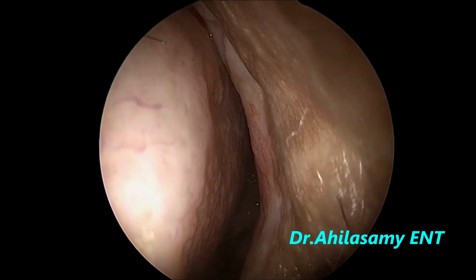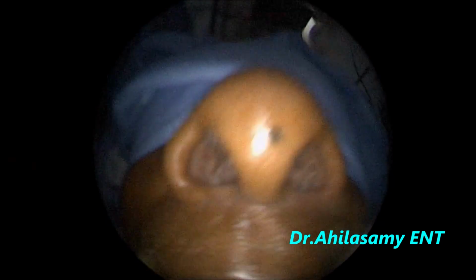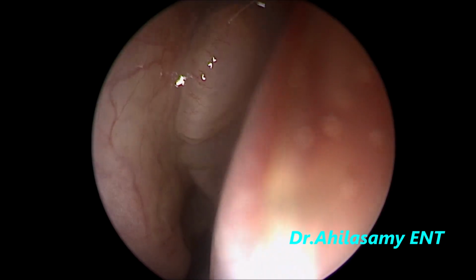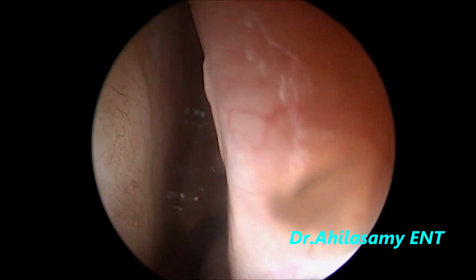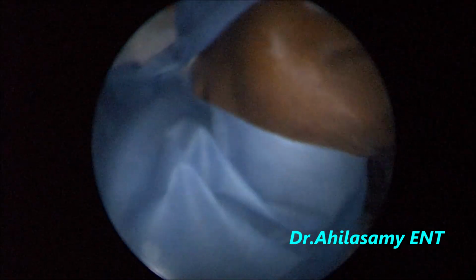This is a diagnostic endoscopy. Septal deviation anteriorly is there. This is the nasal cavity. So the whole nasal cavity is filled with a polypoidal, papilloma-like mass in diagnostic endoscopy. So I took the case under local anesthesia.